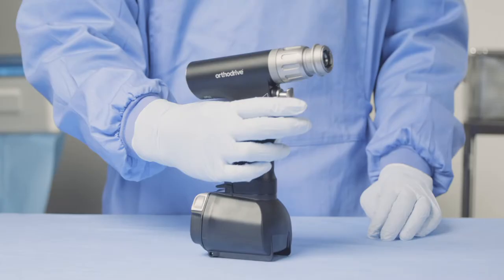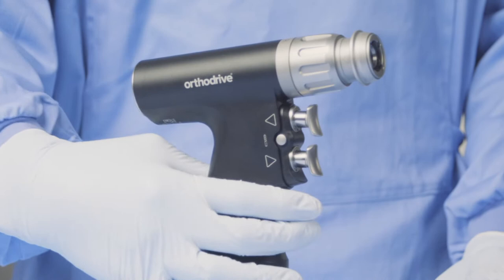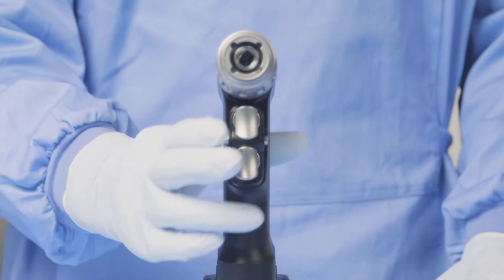Now if I draw your attention to this small silver button known as the mode selector, you will see it's currently in a central position. This is safe mode. This prevents me from depressing either of the triggers and is vital for operator safety.